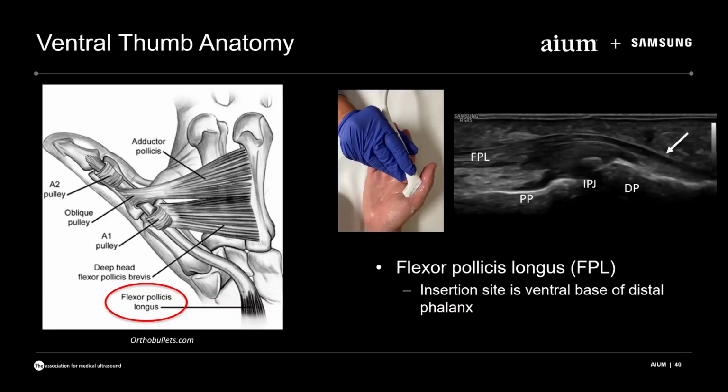And there's often a little ossicle here at the interphalangeal joint. That's normal. It's kind of near the volar plate here. So this area here is if we're imaging right here.